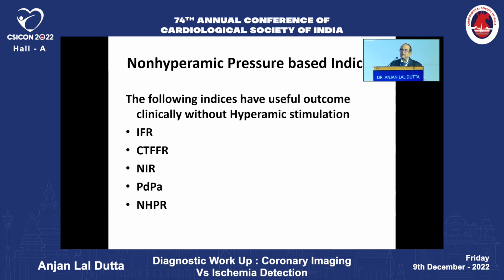But without creating any hyperemia, the index can be measured directly, like iFR, instantaneous wave-free ratio, CT-FFR, totally non-invasive FFR, NIRS, near-infrared spectroscopy, lipid core burden, suggesting another important risk factor that can be taken care of.